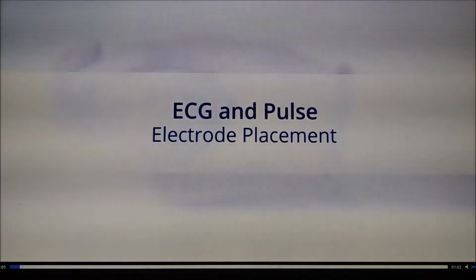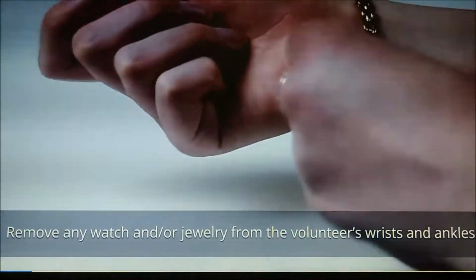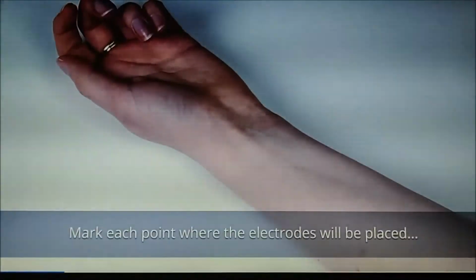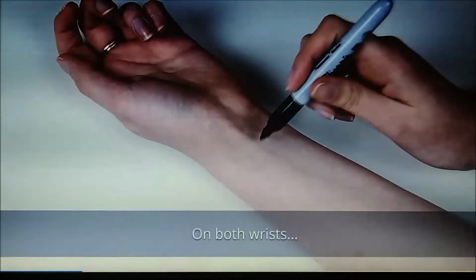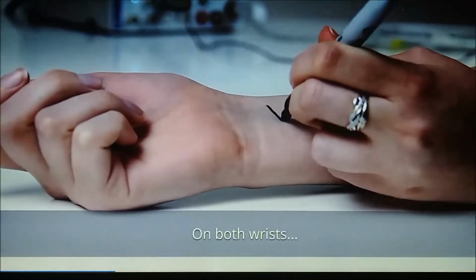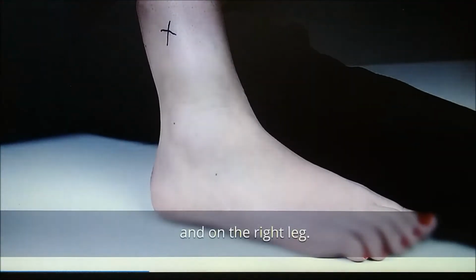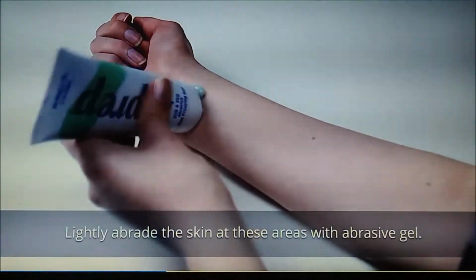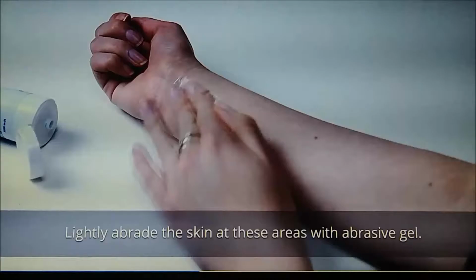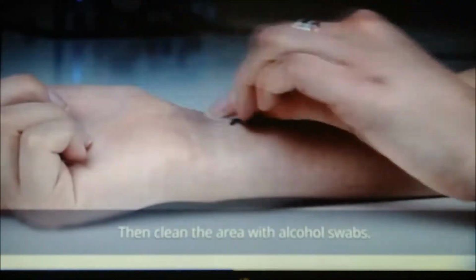ECG and pulse electrode placement. Remove any watch and/or jewelry from the volunteer's wrist and ankles. Mark each point where the electrodes will be placed, on both wrists and on the right leg. Lightly abrade the skin at these areas with abrasive gels. Then clean the area with alcohol swabs.